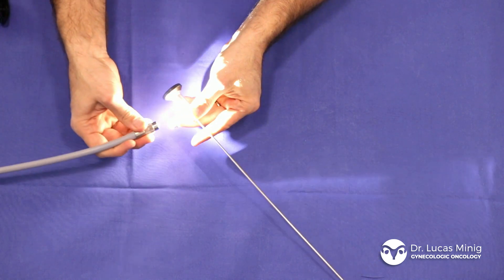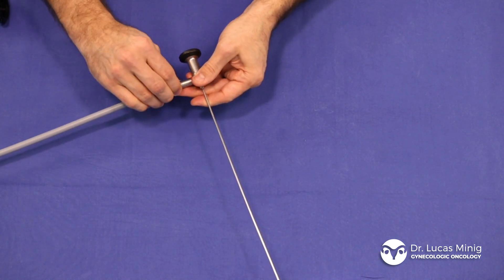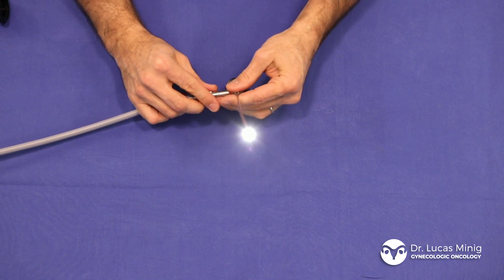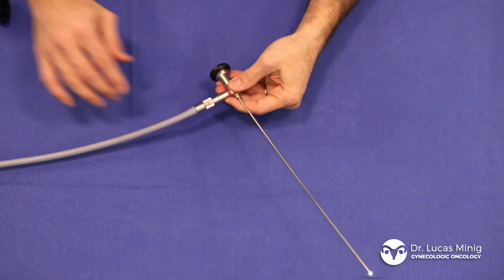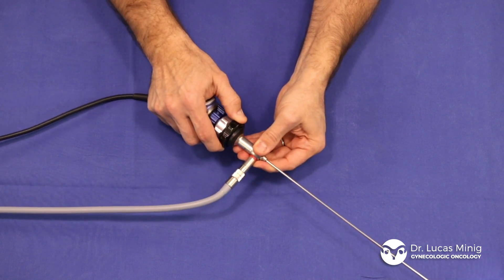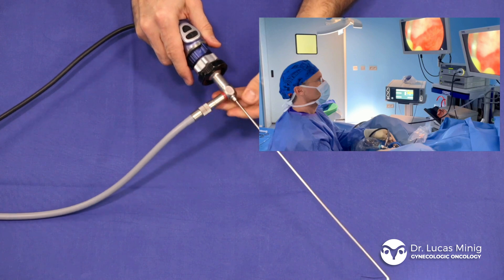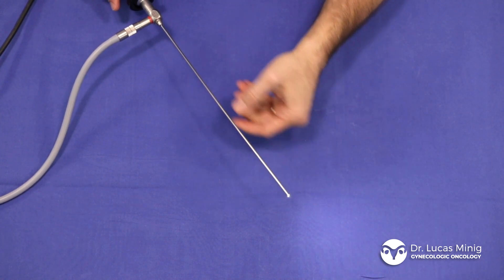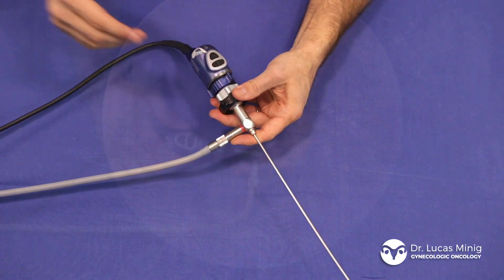At the other end we find an adapter to connect the light source, whose light is transmitted to the end of the optic, and to connect a camera. This camera allows us to project the image produced at the end of the optic onto an external monitor, which helps us perform the surgical procedure with much greater precision and comfort.